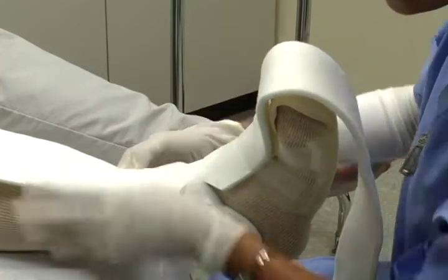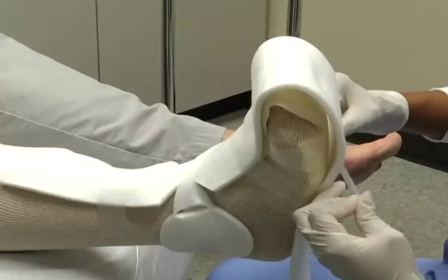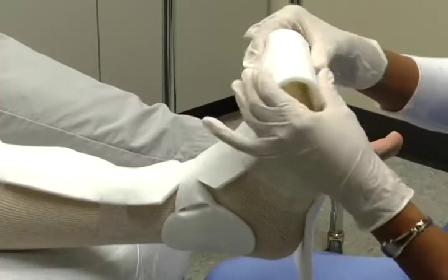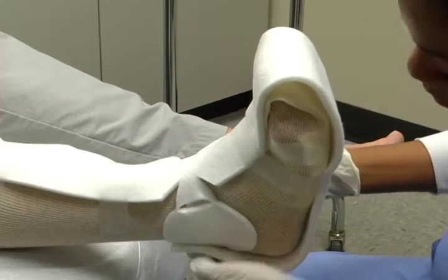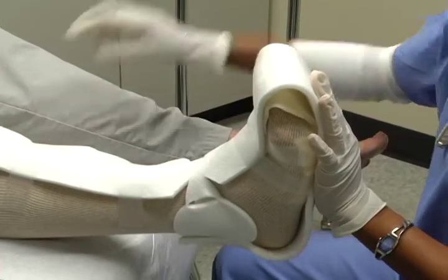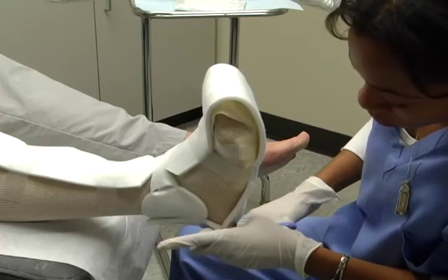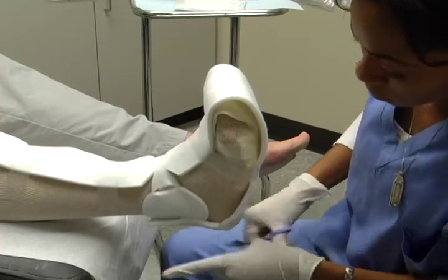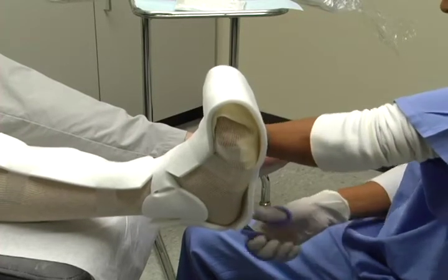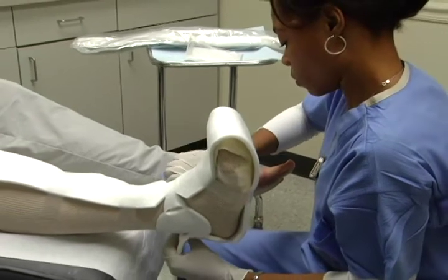Do not tape around the circumference of the leg. Leave a finger's width between the toes and the padding so as not to impinge the toes. Trim the corners at the heel for contouring and cut the padding at the heel, allowing for 1 to 3 inches of excess padding. The patient's leg must be at 90 degrees or the padding will wrinkle.